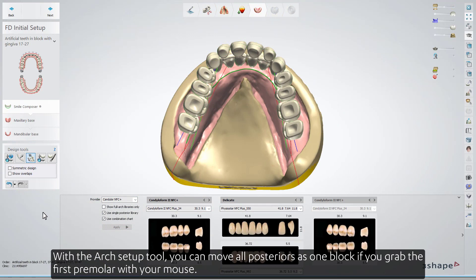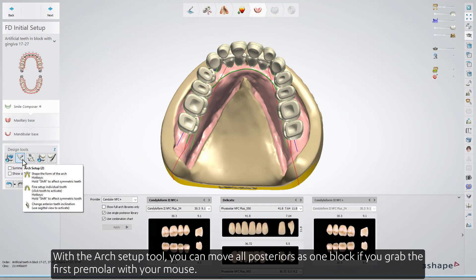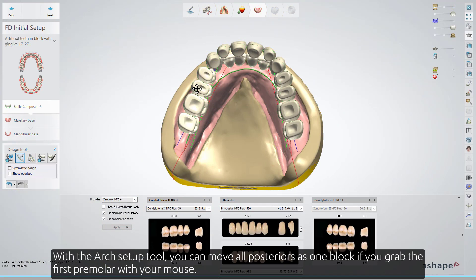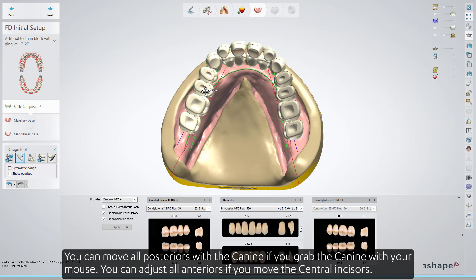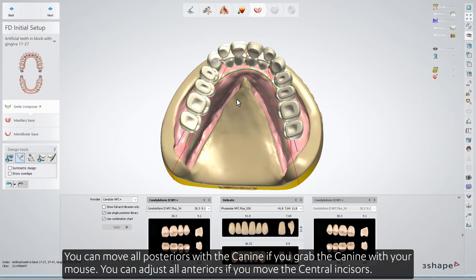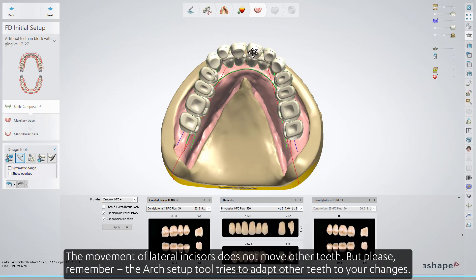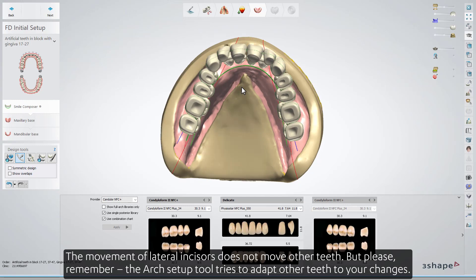With the Arch Setup tool, you can move all posteriors as one block if you grab the first premolar with your mouse. You can rotate the posterior block around the first premolar if you select another posterior tooth. You can move all posteriors with the canine if you grab the canine with your mouse. You can adjust all anteriors if you move the central incisors. The movement of lateral incisors does not move other teeth. Remember, the Arch Setup tool tries to adapt other teeth to your changes.